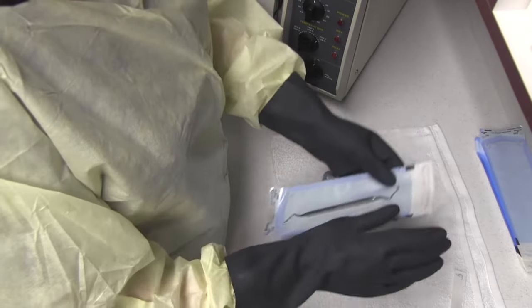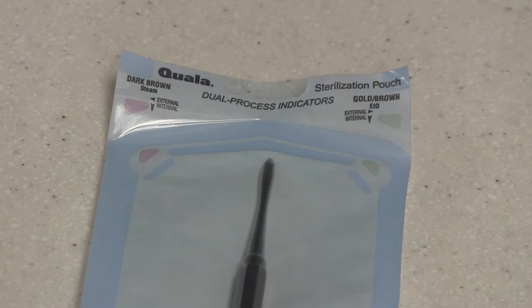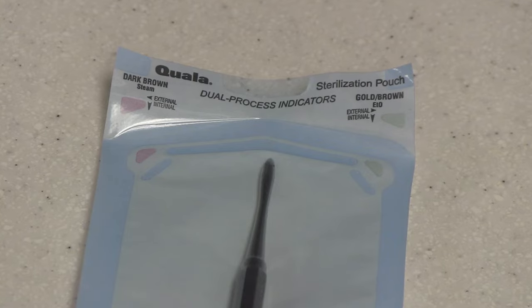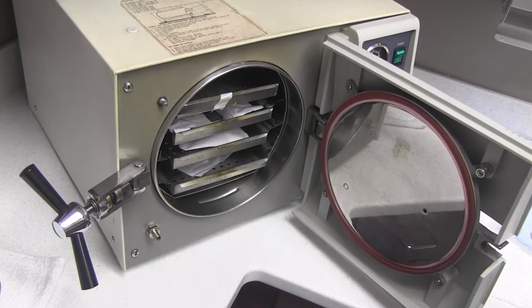Now we'll look at the sterilizing process itself — first, how to sterilize using an autoclave. To use the autoclave, place the pre-cleaned instruments in heat-resistant pouches. Most packaging has process indicators built-in, but place an indicator into the bags if necessary. Put the packages in the autoclave, making sure to leave space between each item.